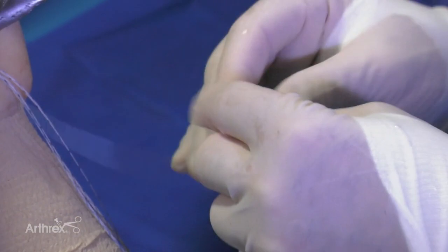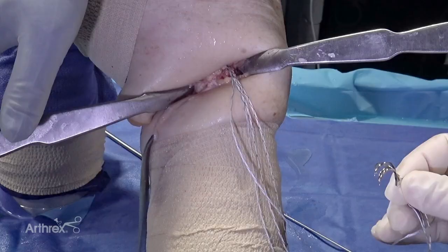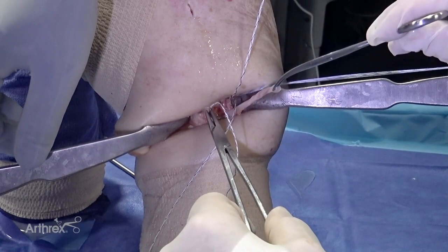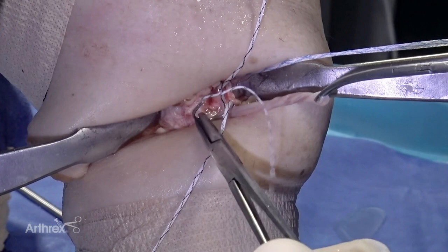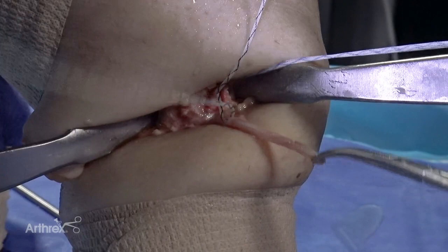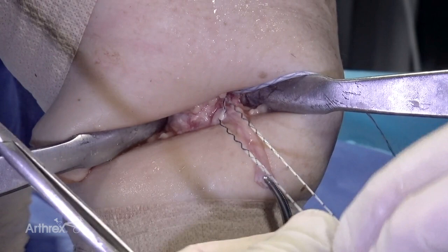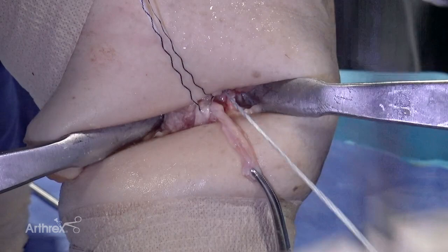So we have two suture tapes of different colors, which makes it very easy to manage. We remove the plastic covering of the sutures. We'll do some type of modified Kessler or Krackow or Mason-Allen suture on the tendon, several passes through the tendon. In this case, it's a very small tendon, so we'll work with one limb through the tendon. So really, you can think of the post limb as the limb that's not passed through the tendon. And we'll snap that and keep that out of the way. Grab the other limb. Again, these will slide through the base of the anchor, so it's a sliding stitch.